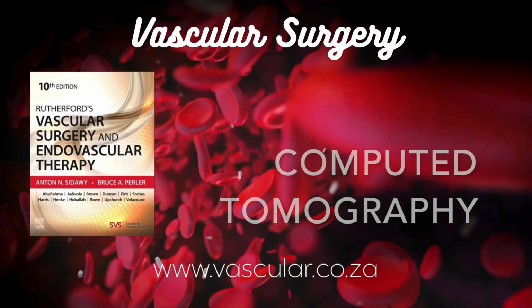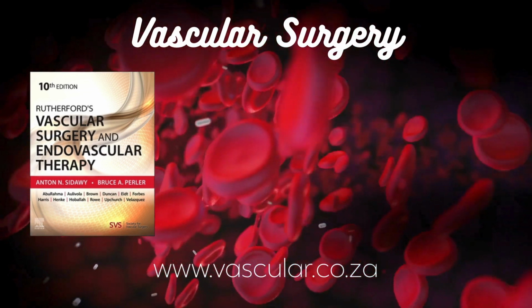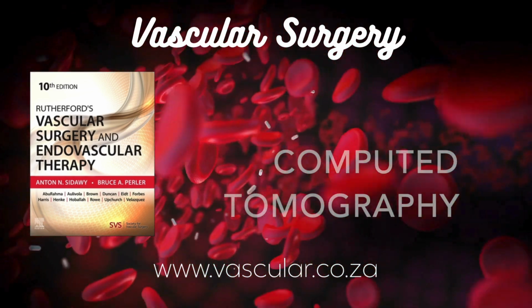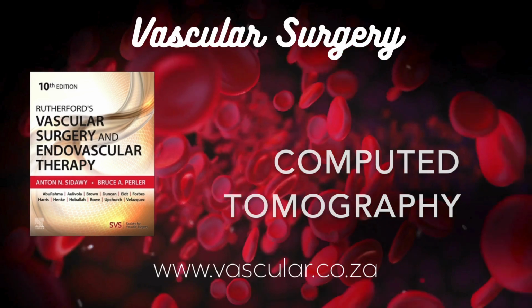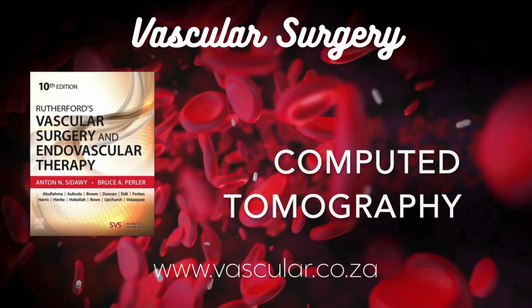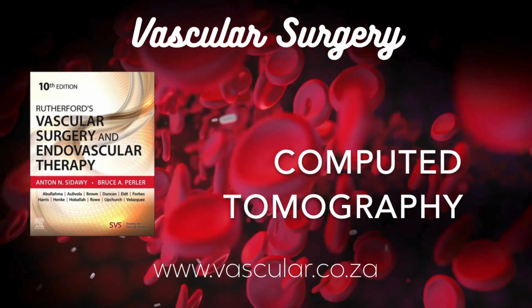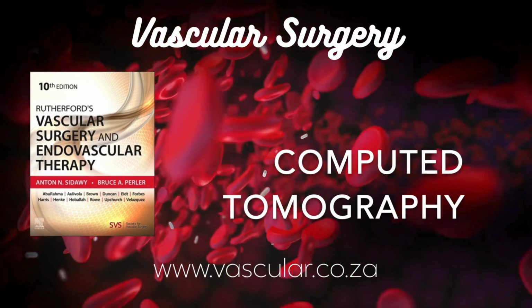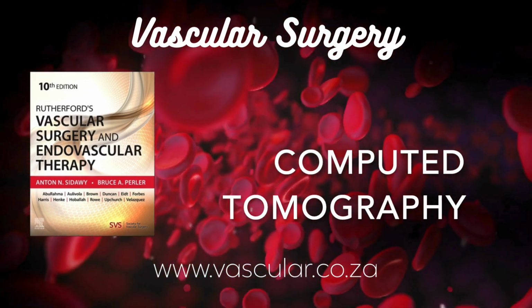It rotates around you, taking hundreds or even thousands of these attenuation measurements from every angle. And then the computer steps in. Yep. All that raw data gets fed into the computer, which uses complex algorithms building on the work of Cormack and Hounsfield to calculate the density of the tissue at every single point within that cross-sectional slice. Oh, the density value, that's the Hounsfield unit. That's it. The CT number, measured in Hounsfield units, or HU, named after Sir Godfrey, of course.